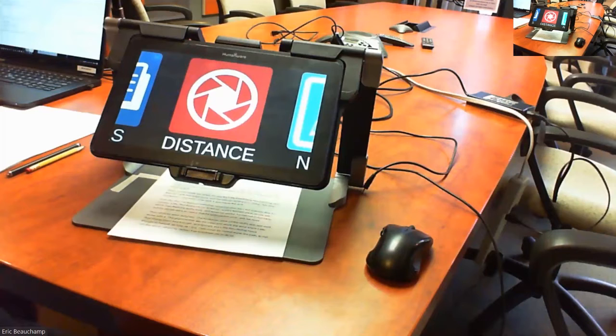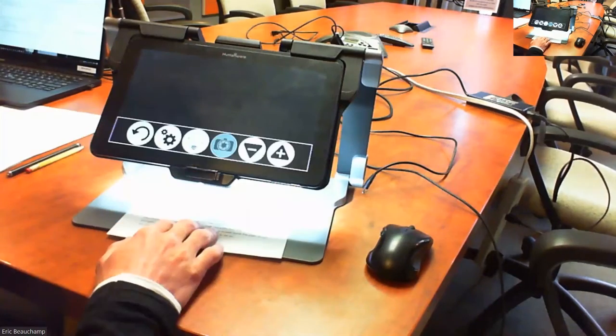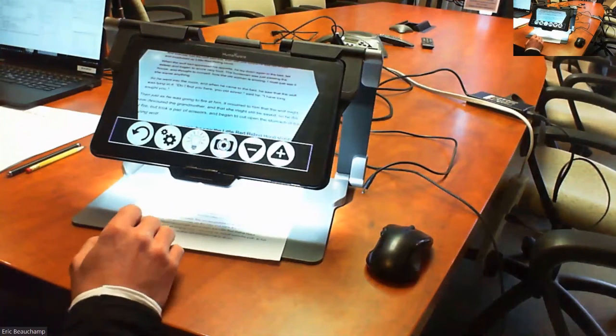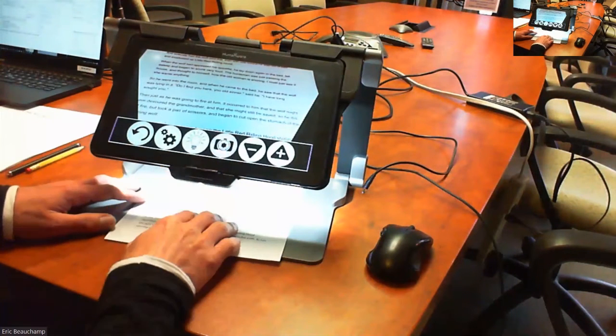Next question, are you able to highlight or circle on the screen to optimize the student viewing specific targets or elements? Okay, so I'm guessing the question is you'd like to circle on a live image. So for example, if I'm in Magnifier, you have a piece of paper underneath and I'd like to circle something on the image. Well, you can do so, but you have to take a picture. You have to take a capture of what's underneath.